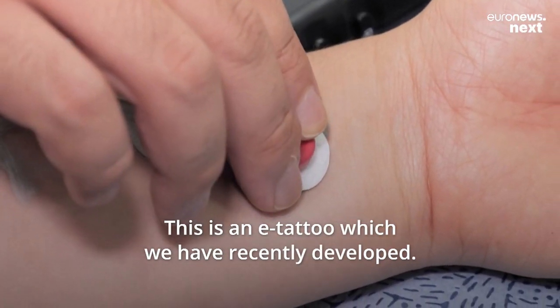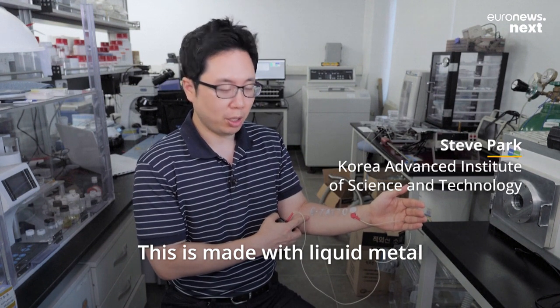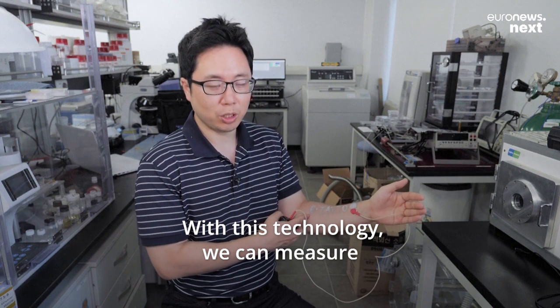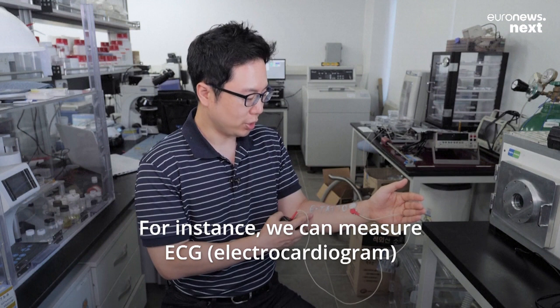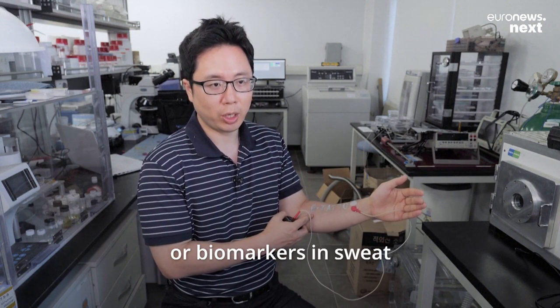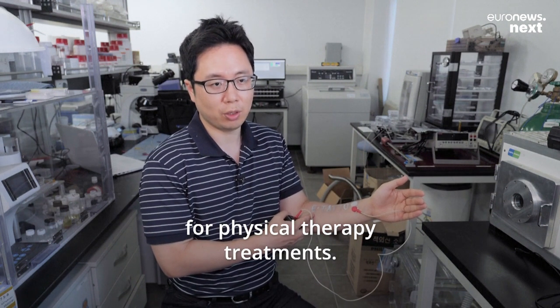This is eTattoo, which we have recently developed. This is made with liquid metal and combined with carbon nanotubes. With this technology, we can measure various types of signals coming from the body. For instance, we can measure ECG or biomarkers in sweat, and also we can use it as a heater for physical therapy treatments.